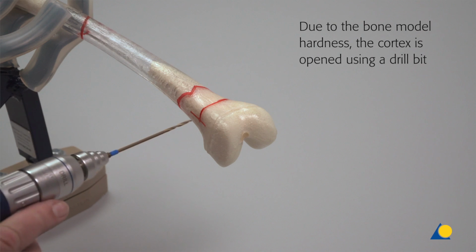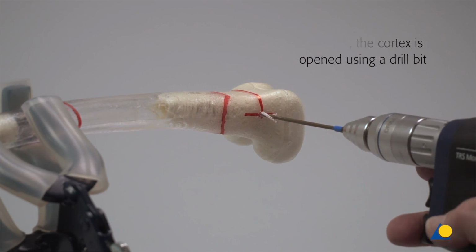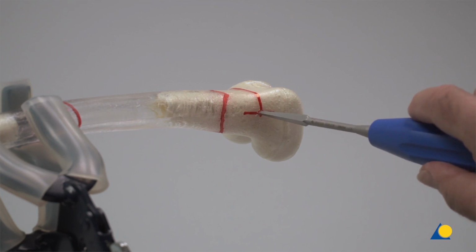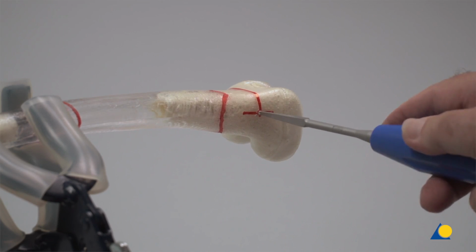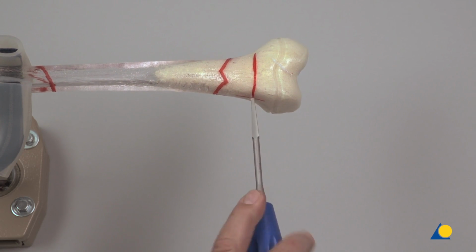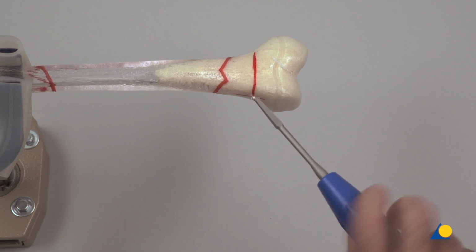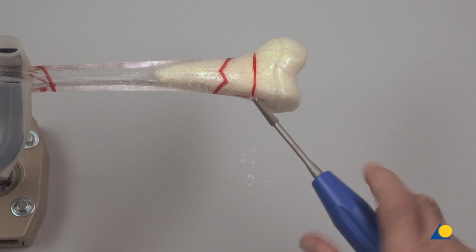A 2.5 mm drill bit is positioned at 90 degrees at the entry point and is used to open the cortex. The awl is inserted perpendicular to the bone and a central mark is made with oscillating movements. The awl is advanced into the metaphysis with full rotational movements. Once the awl has secured a purchase in the bone, it is lowered to an angle of 45 degrees in relation to the shaft axis, and the bone is perforated at an upward angle.